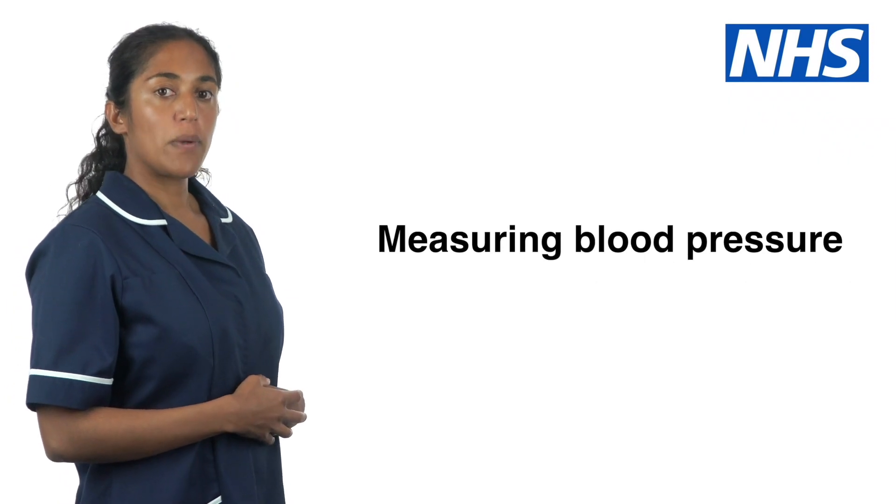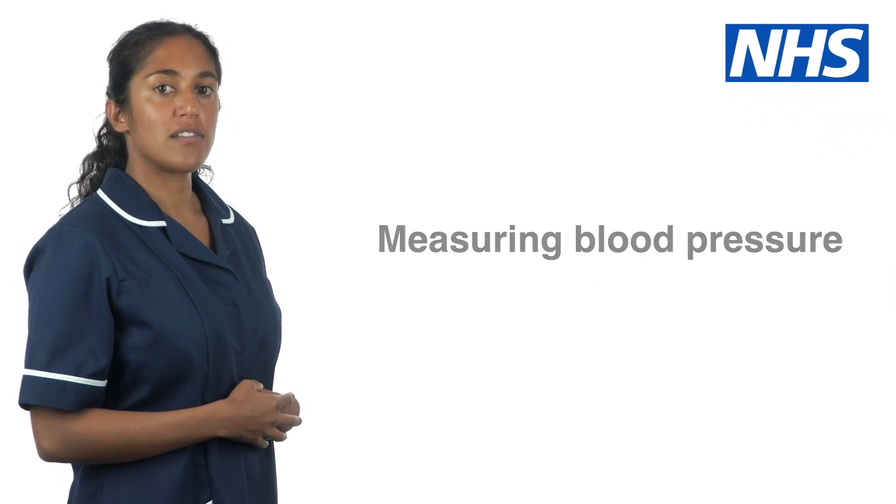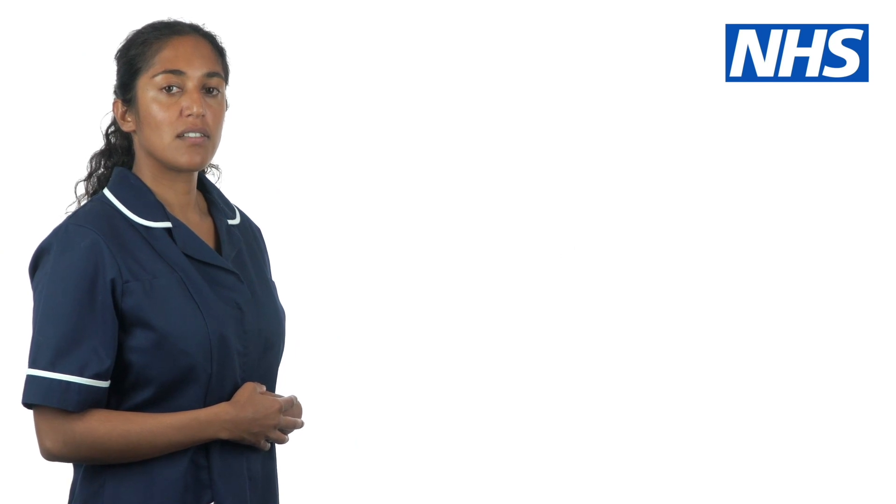Hello. Blood pressure, or BP, measures the force that your heart uses to pump blood around your body.